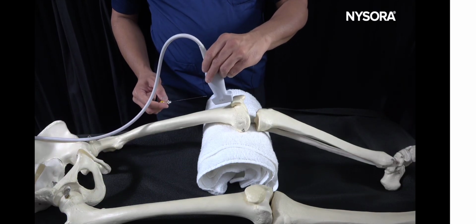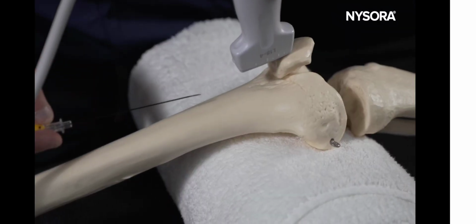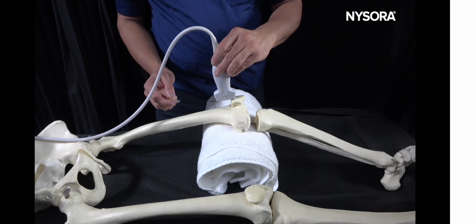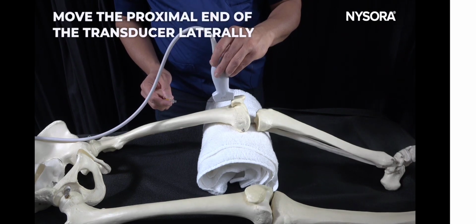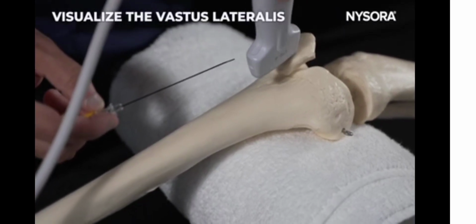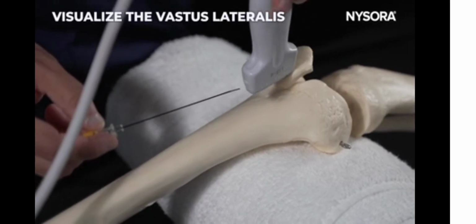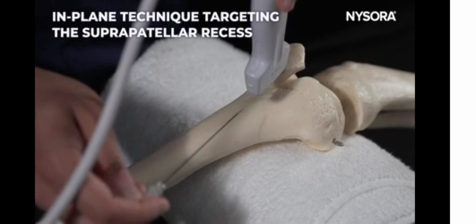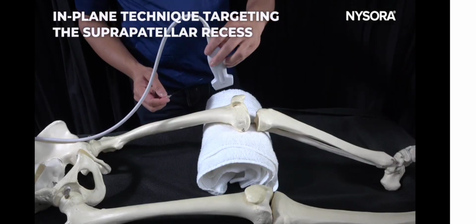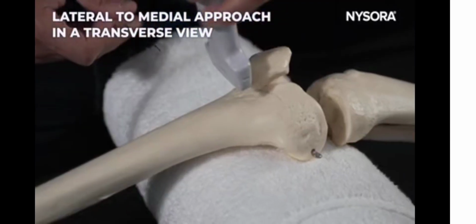You could inject this using an in-plane technique. The most important structure that will be in your way would be the quadriceps tendon, and putting the needle through the quadriceps tendon can be very painful. So the tip here would be moving your ultrasound probe's proximal end slightly laterally and looking at the vastus lateralis muscle rather than focusing on the quadriceps tendon, and you'll be able to bring the needle in plane targeting the suprapatellar recess.